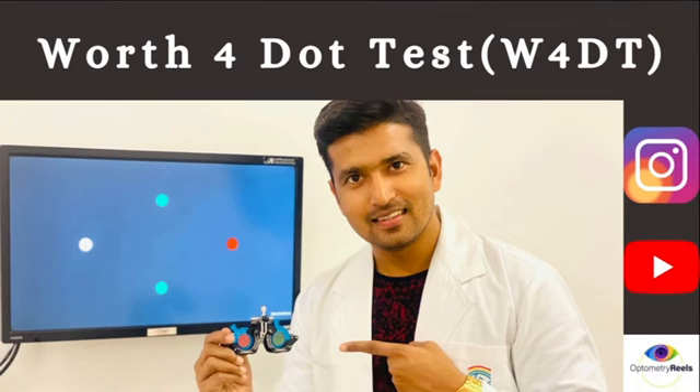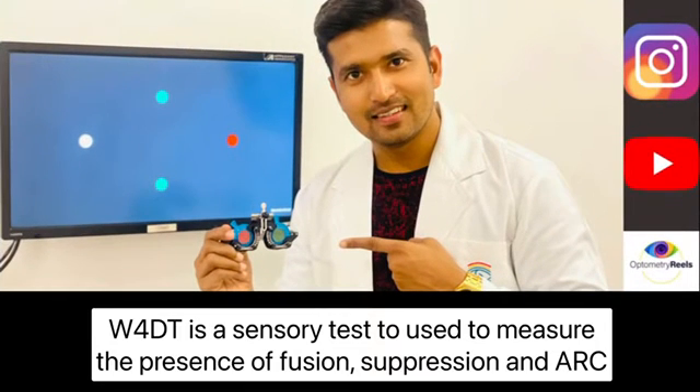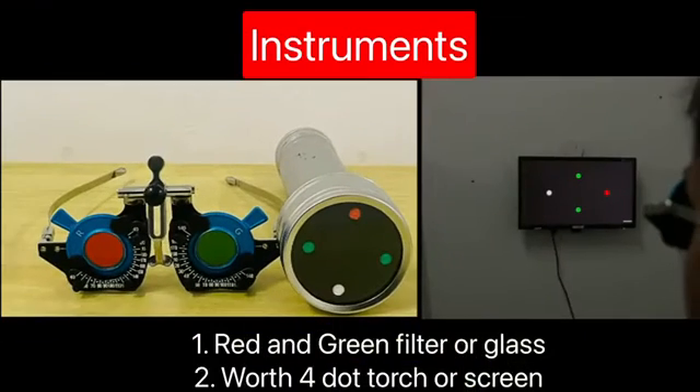Hello everyone, this is Dr. Noor, welcome to Opto Materials. In this session we are going to discuss the Worth 4-Dot test, its application and importance in clinical practice. The Worth 4-Dot test is a clinical test which assesses the degree of binocular vision. This sensory test is useful in detection of suppression, diplopia, and anomalous retinal correspondence, mainly seen in conditions like amblyopia, nystagmus, and strabismus.